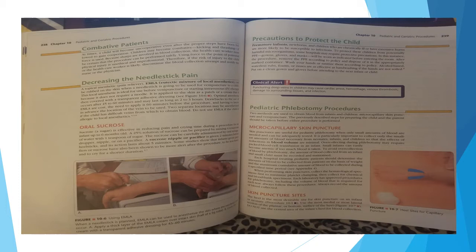To avoid overcollection of blood by phlebotomy, the amount of blood collected from the infant and child must be recorded and maintained. Each hospital treating pediatric patients should determine the amounts of blood to be collected from patients on the basis of weight and the maximum cumulative amount of blood to be collected during a specified time period. When performing skin punctures, collect the hematological specimens first to minimize platelet clumping. Then collect for chemical and blood bank specimens. Each laboratory has approved procedures for phlebotomy, including the volume of blood that is required for each test. Always follow these procedures. Always record the amount of blood collected.